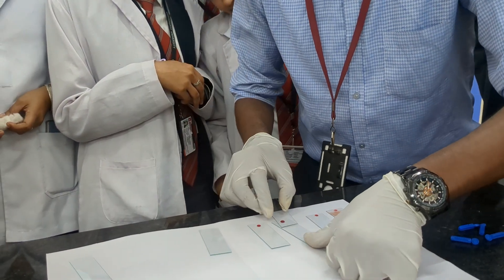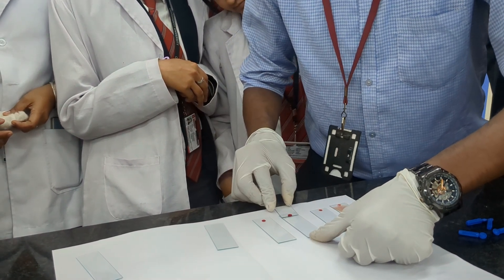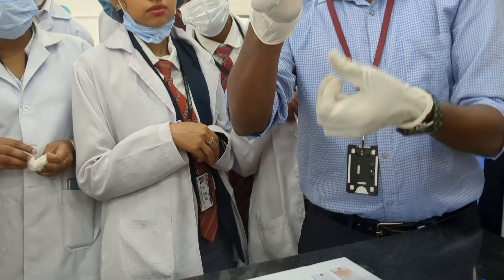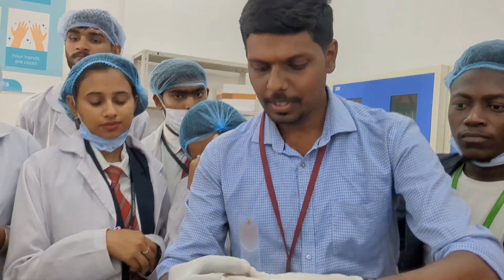Take another slide. Ensure that the blood is spreading evenly, then spread it. Now we got a tongue-shaped smear properly. Can you see the tongue-shaped smear? This is a proper tongue-shaped smear.